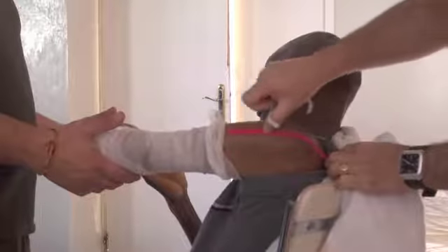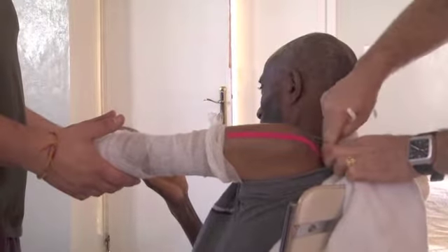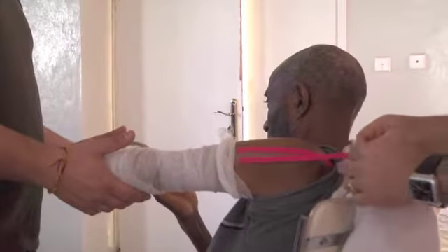Then we're going to apply the tape over the arm. So the tape is 20 centimeters, which means from the bandage up until over the shoulder, between one tape and another.